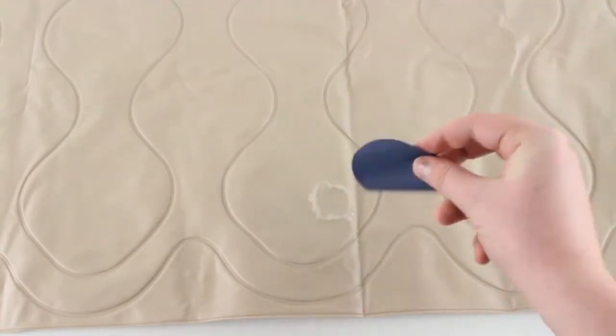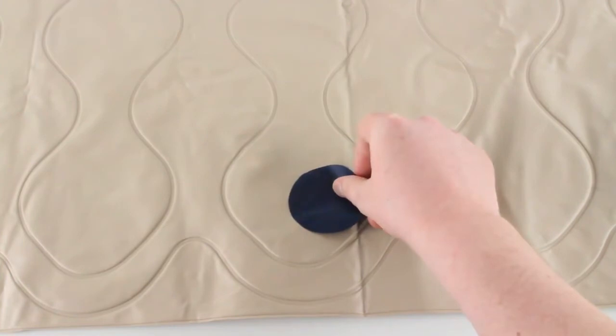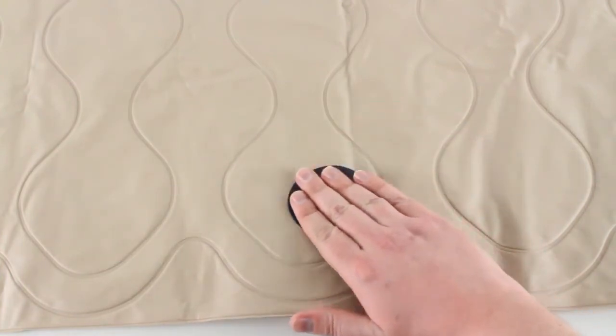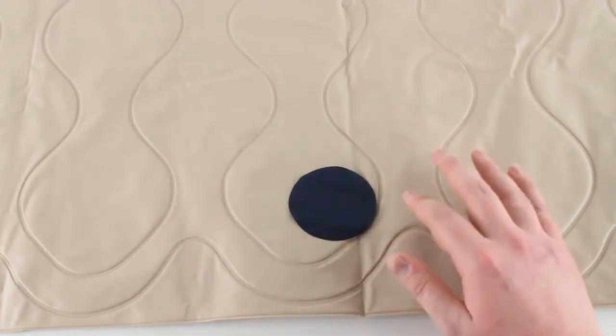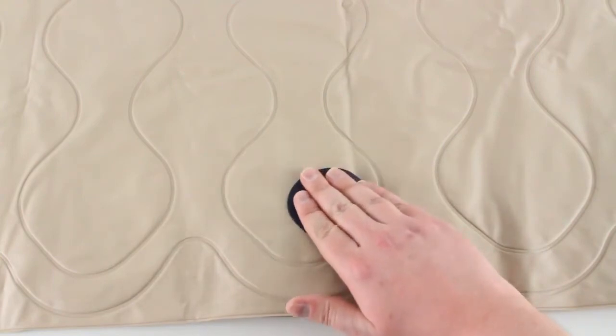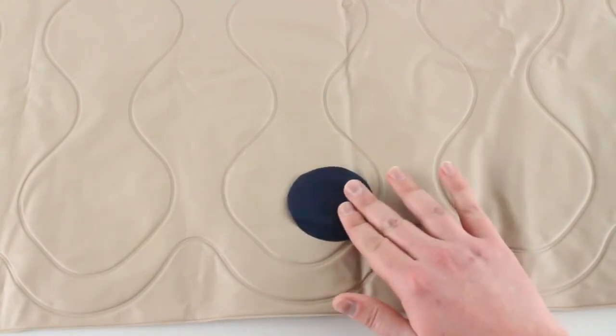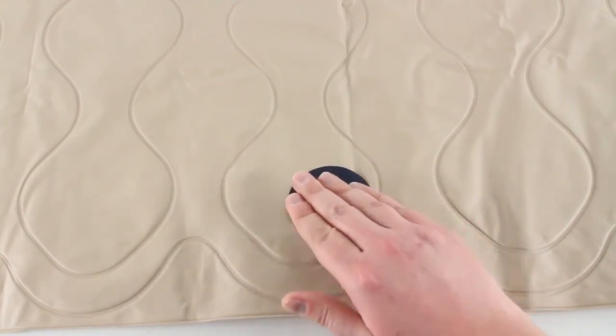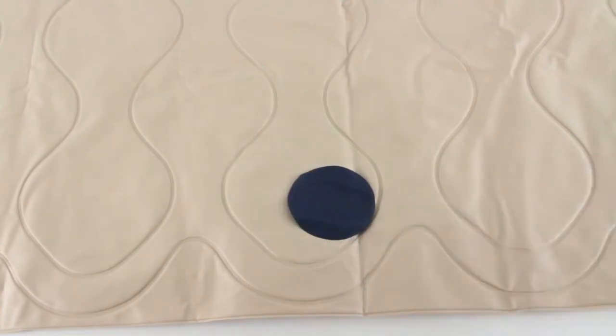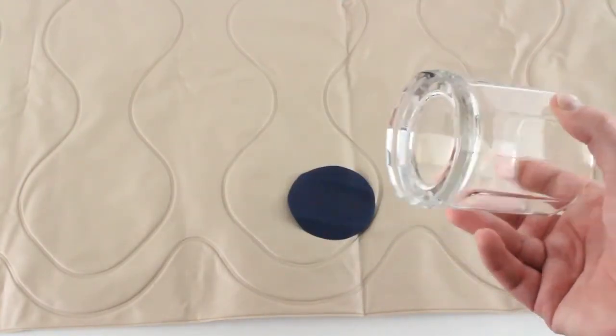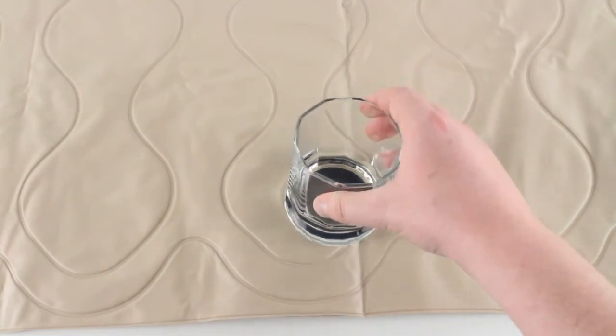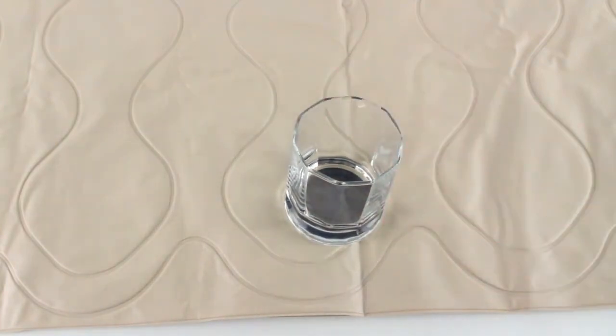And then take that patch, shiny side down, lay it right down over the patch or over the hole. You want to make sure it gets a good seal, but you don't want to squeeze it too hard and push the glue in. Get something moderately heavy. I just got this drinking glass here. Set it down on the patch. Leave that there.